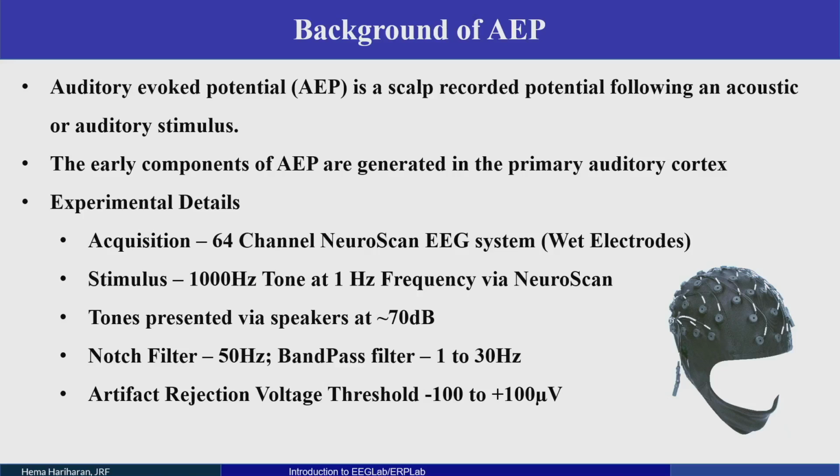These tones can be presented in whichever manner, through headphones or by speakers. In this experiment, we gave the AEP through the speakers.